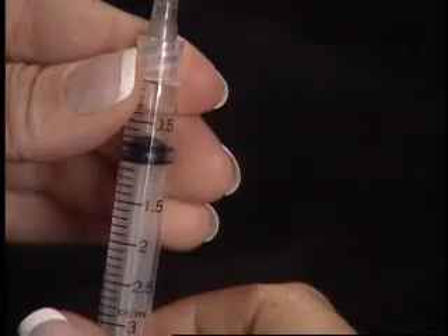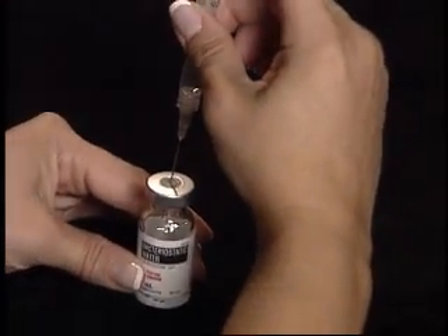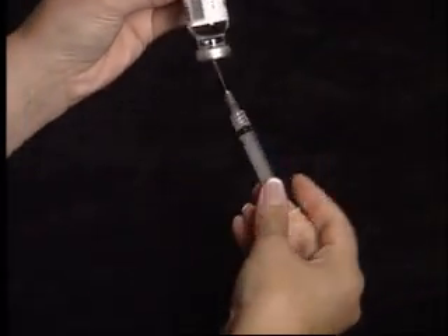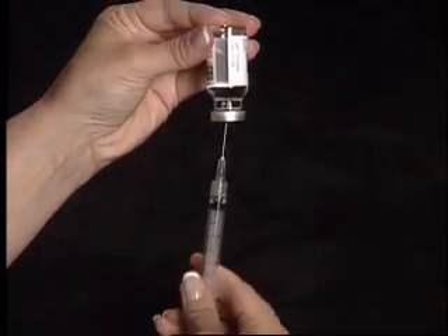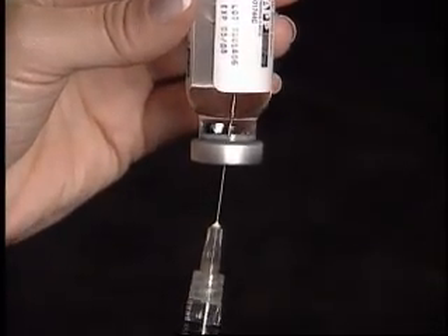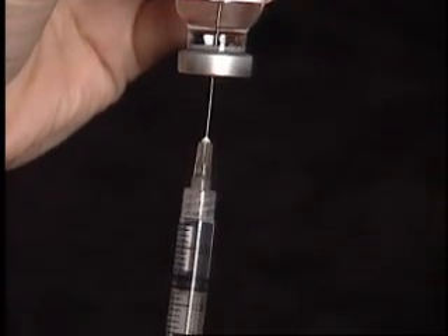Withdraw 1 cc of air into the syringe and inject into the vial of diluent. As one complete unit, turn the vial upside down so that the tip of the needle stays below the liquid level, and pull back on the plunger to withdraw 1 cc.